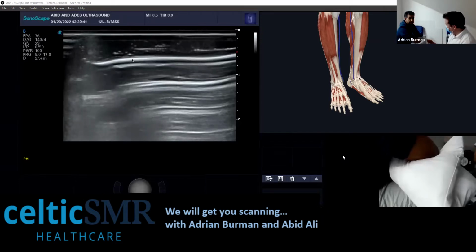Any more common injuries than others that you tend to see more of? I think the most common one is probably your lateral epicondylosis, your tennis elbow. That's what we tend to see most of, or I tend to see most of. Don't get that many elbows come through, to be honest, and if they do, they tend to be mainly those. Get an occasional, just looking for foreign bodies or effusions or olecranon bursitis, things like that. But if it's an elbow, it tends to be lateral elbow pain, lateral epicondylosis, and tennis elbow, and things like that.